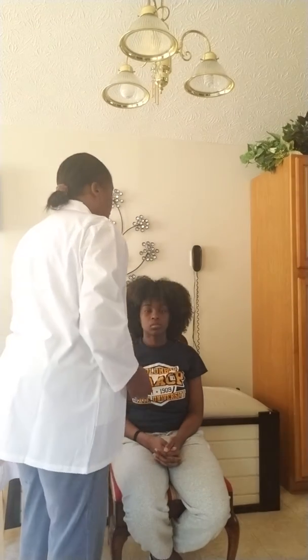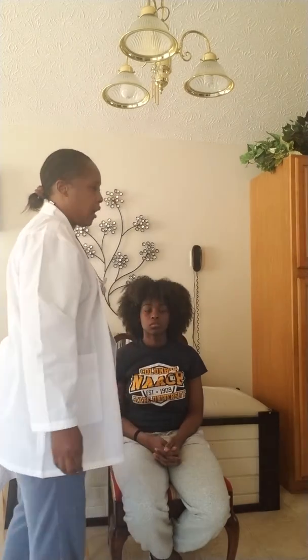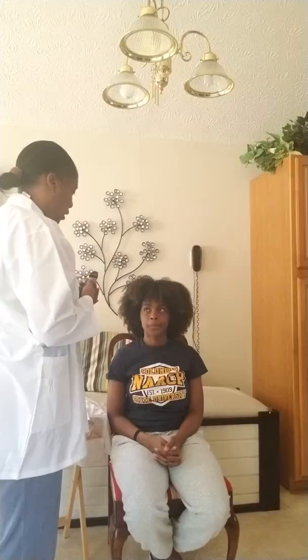Also, I'm looking at the lacrimal glands. Sometimes you can press down to make sure there's no drainage, and hers is not having any drainage. And now I'm going to finish my eye exam by checking her. I'm going to do the fundoscopy test.